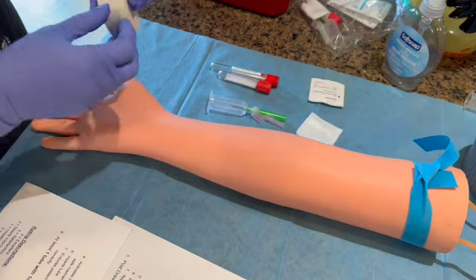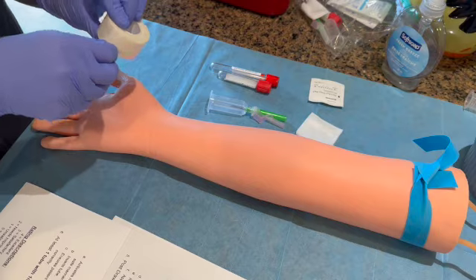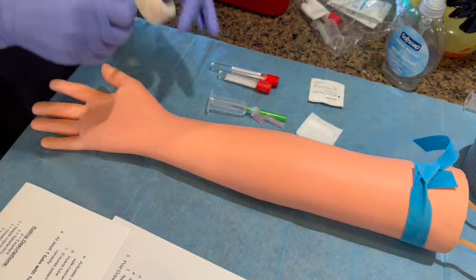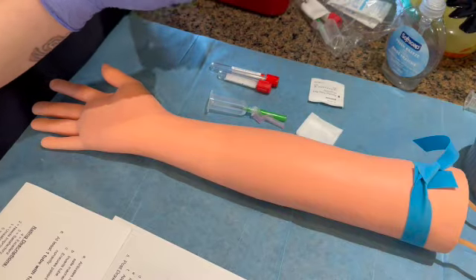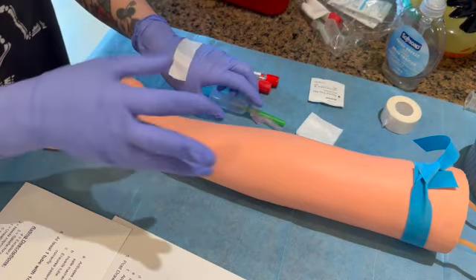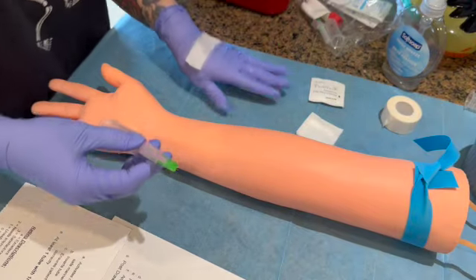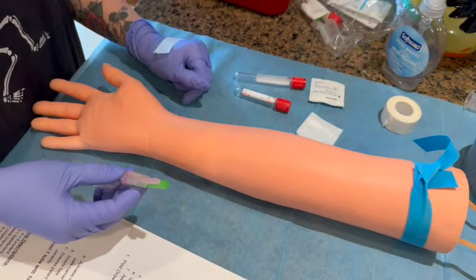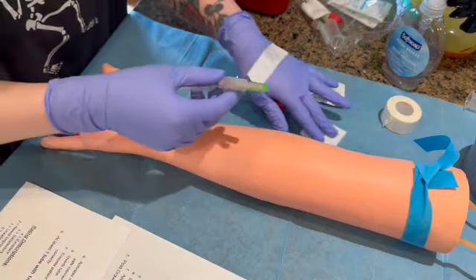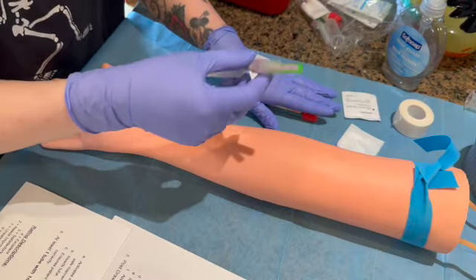We're also remembering that whatever your non-dominant hand is going to be the side that you're preparing the rest of your equipment. We're gonna prep our tape here, have that on my glove. And now since I am right-handed, all of my equipment that I need to access during the venipuncture is going to be readily available right here on the left side.